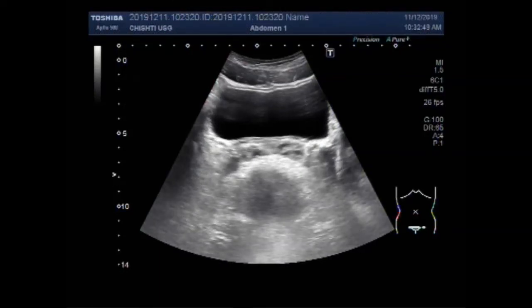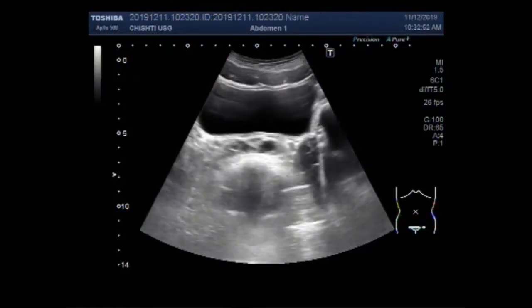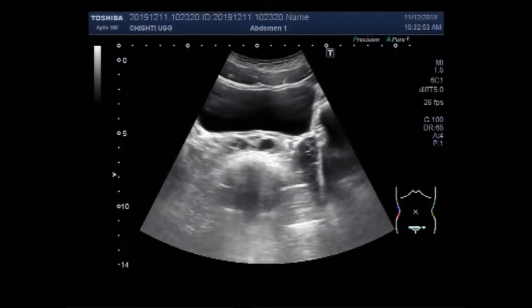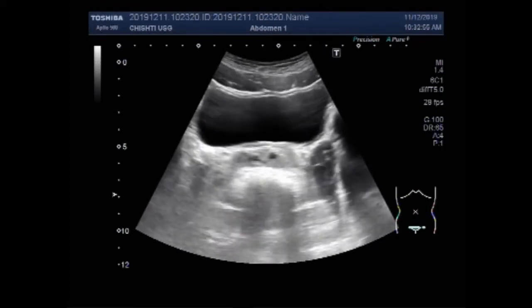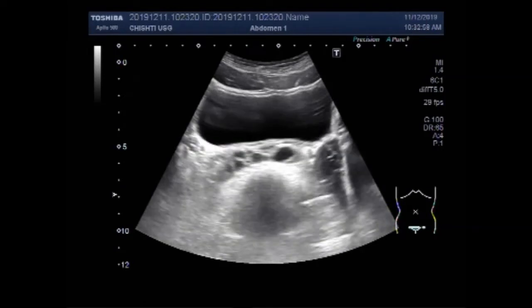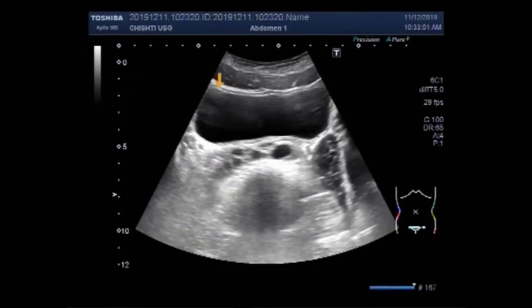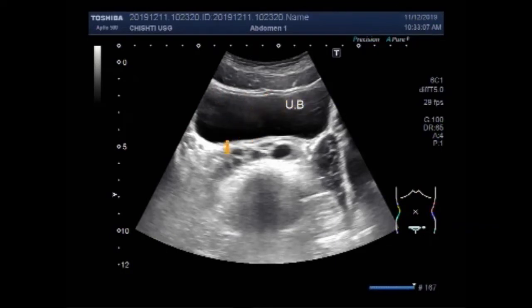Dear viewers, I hope you are all fine. This ultrasound video shows bilateral enlargement of the seminal vesicle. This is not a common problem, but you will see occasional cases in your daily clinical practice.